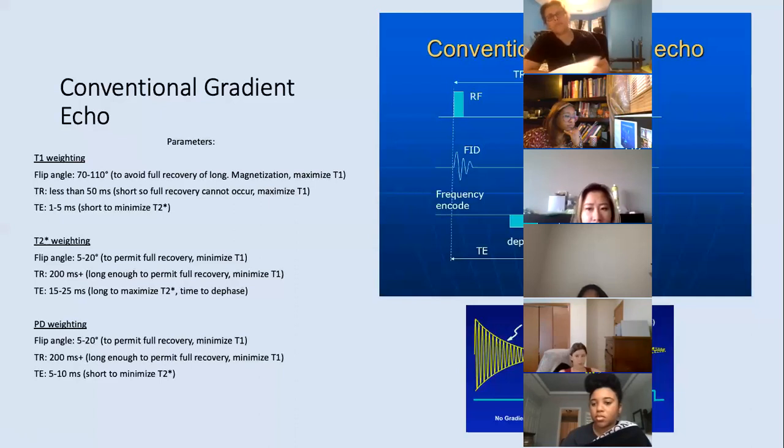So you're basically putting more RF exposure into the patient that could potentially heat up their thermoregulatory system more than is desired. It's never been recorded, but it could potentially cause what we call a heat stroke, where your internal body temperature gets too hot and you've malfunctioned.